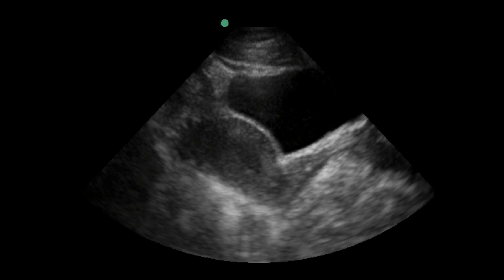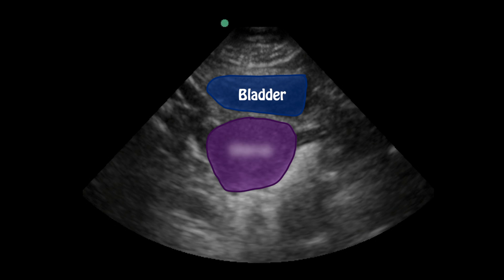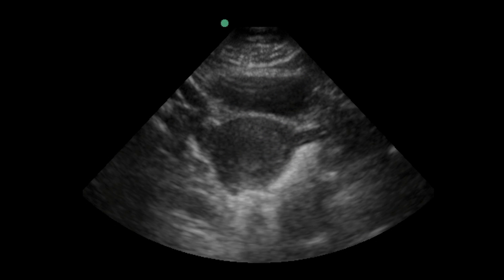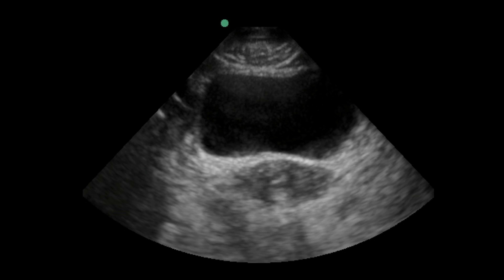After evaluating the entire uterus in long axis by fanning right to left, we're going to go to a short-axis view. We rotate the probe marker from angled towards the patient's head towards the patient's right. We can see the bladder at the top of the screen and then the uterine fundus. We fan from the fundus down to the cervix. One thing to pay attention to is that one side just looks a little odd compared to the other, which is pretty normal appearing. As we fan inferior we reach the vaginal stripe, letting us know we've evaluated the entire uterus.